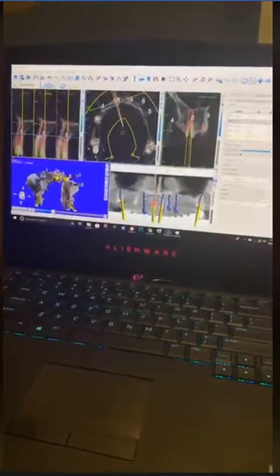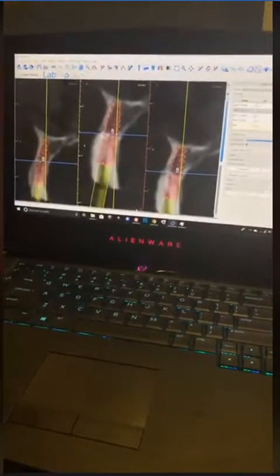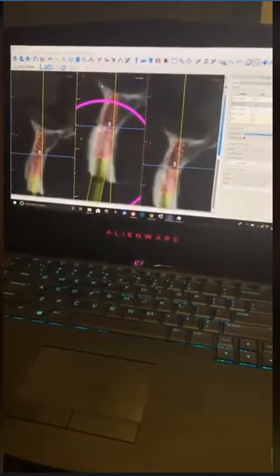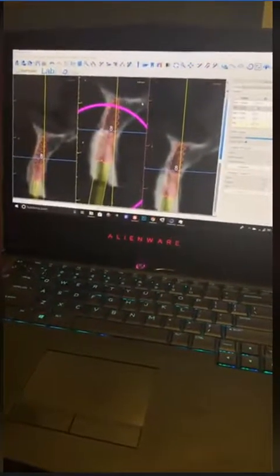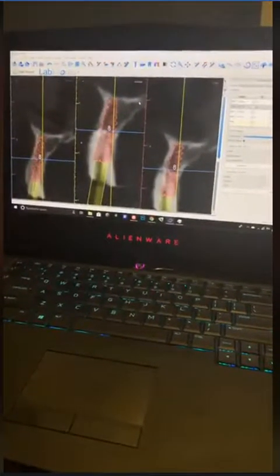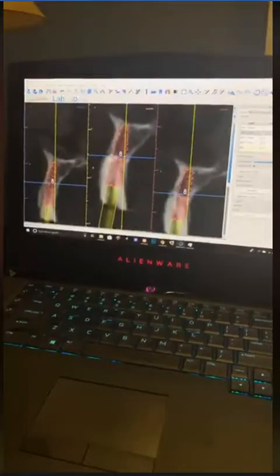Number 8 is 375 by 13, and we're actually engaging the cortical level of the nasal, just the inferior nasal cavity. Okay, so yeah, you have a nice connection to that. Okay, you could only do that with a guide.